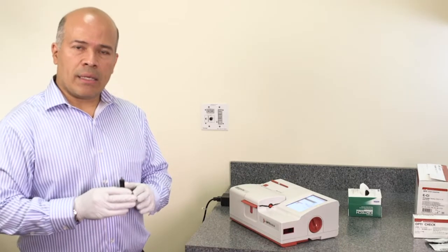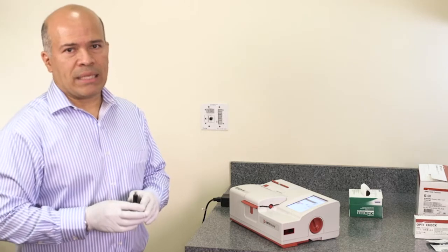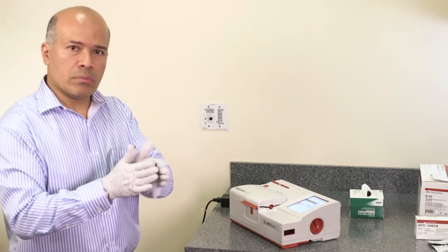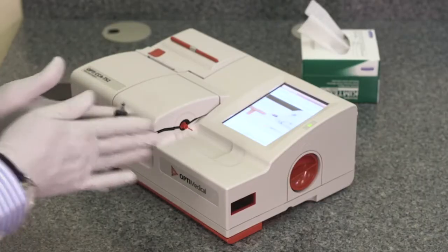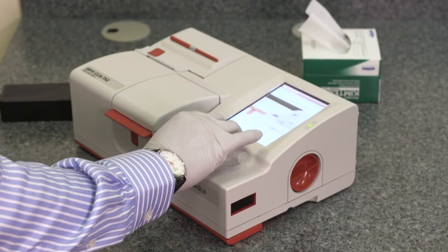The cassette calibration takes about one minute. Once the cassette calibration is done, the instrument prompts the user to mix and place the sample. Take the sample, mix it, and make sure the sample doesn't have any air bubbles. Place the sample on the syringe adapter.